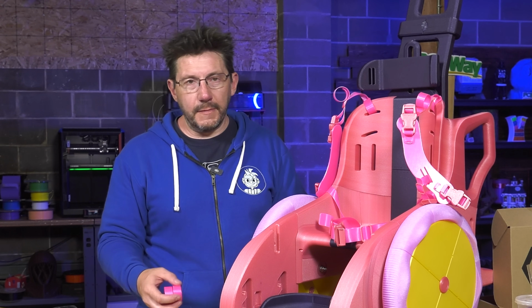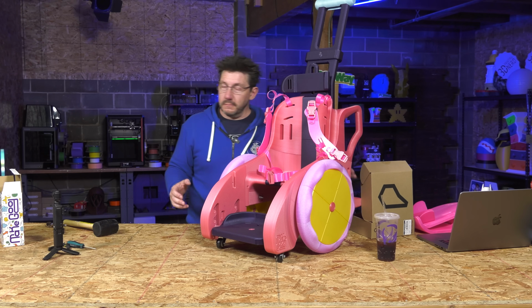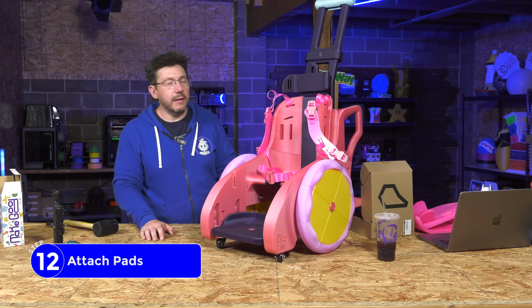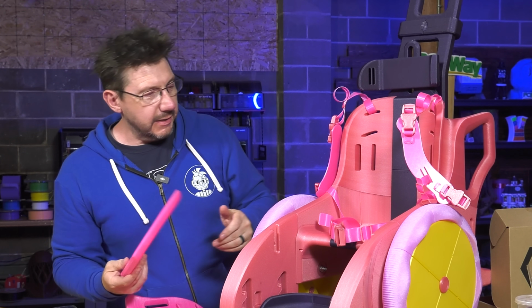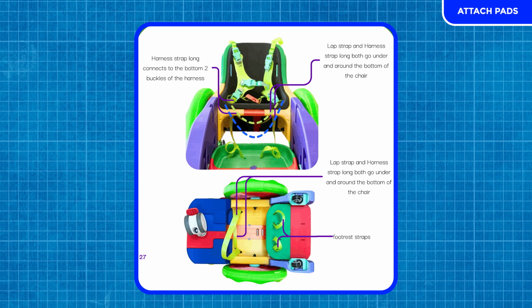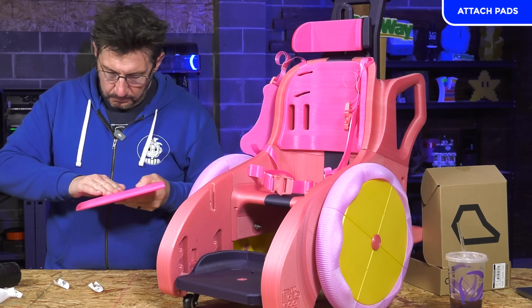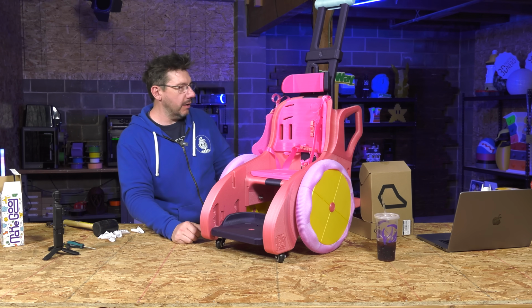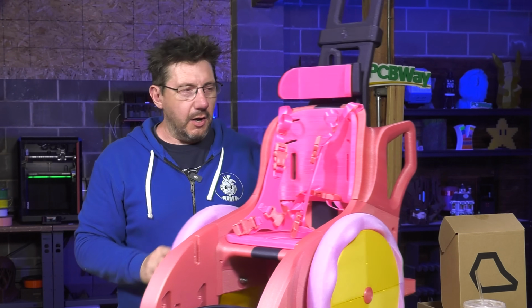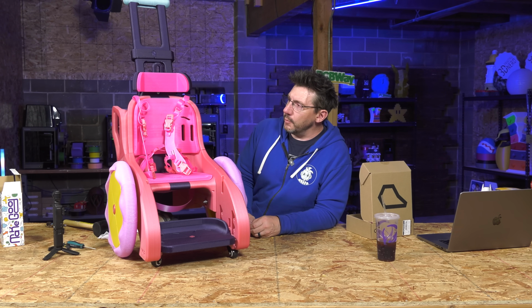So for this, what I'm gonna do for little Siobhan's family, we're going to keep these straps and those buckles separate. And last, what I'm gonna do before I consider this good is attach the pads. That's these things. And make it so they can use them. There are holes in the pad to feed the buckles through. There we go. Pads are in, wheels are good, the front tray is good. I've got belts, buckles, I've got all sorts of really cool things. It rolls really well. Oh, I can't wait. Yes! This is gonna go to a little girl named Siobhan, and I hope she really enjoys it.